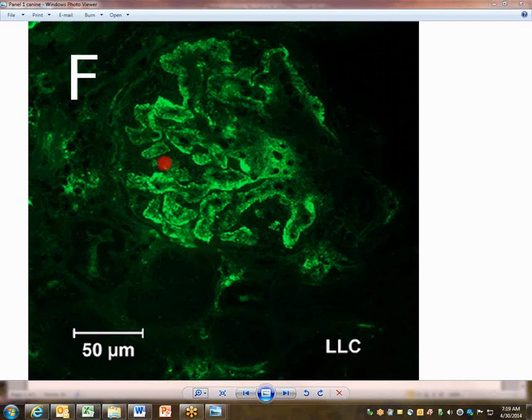And then if you have that idea in your head, these are almost confluent, and you wonder whether it's the picture or exactly how it's stained there. But you get a sense of granular fluorescence, which is consistent with the deposits we just saw. And in places you wonder about it extending into the mesangium; for instance here, you might say there's mesangial staining as well in that area. Okay, so we're going to go to the diagnosis because we have a lot of cases.